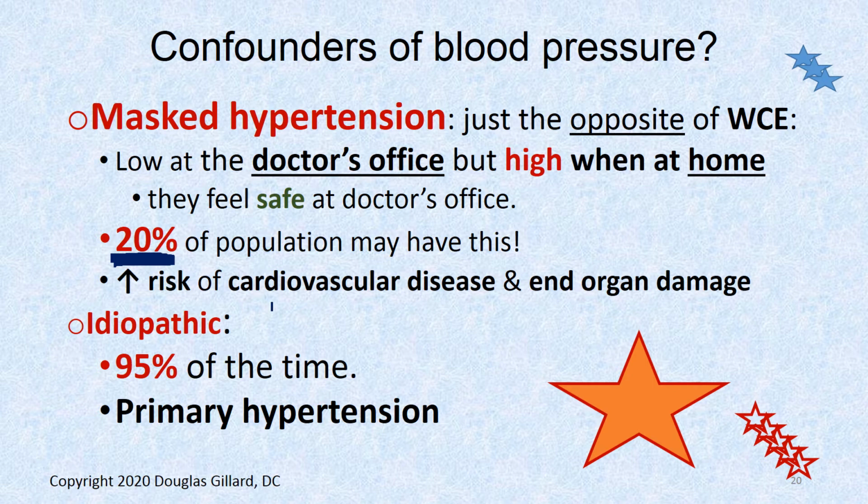So again, it's probably a good idea before you ever put anybody on blood pressure meds to give them a home unit or have them buy one. Those things are very accurate. Those ones you can buy. Most of them are. So that's another interesting little tidbit there.